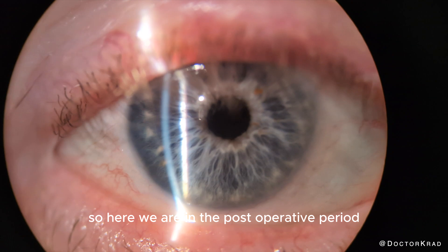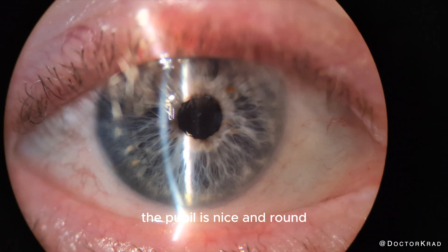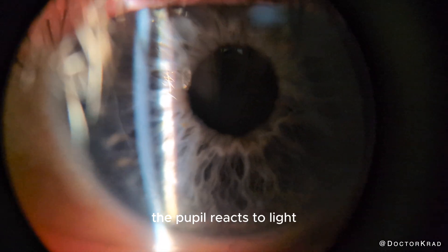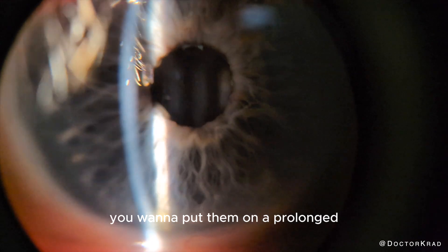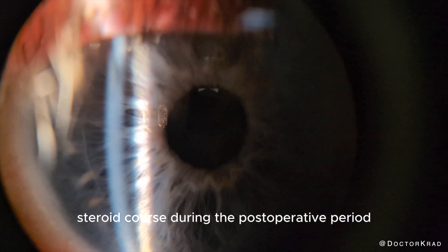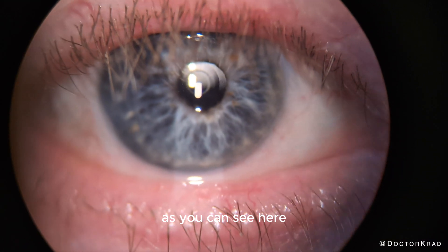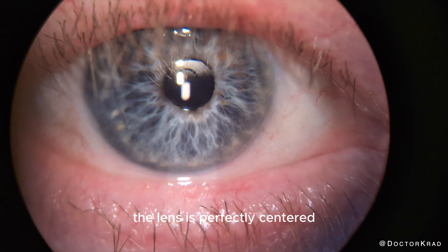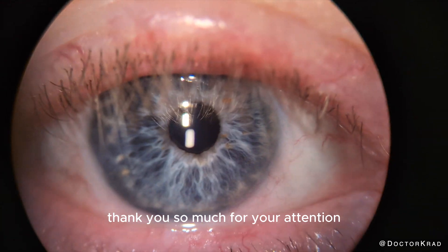Here we are in the post-operative period. As you can see, the pupil is nice and round, and fortunately the pupil reacts to light. In patients with a history of uveitis, you want to put them on a prolonged steroid course during the post-operative period. I had this patient also follow up with their retina specialist. As you can see, the lens is perfectly centered and their vision was 20/25 uncorrected. Thank you so much for your attention — I'll catch you on the next one. Peace.